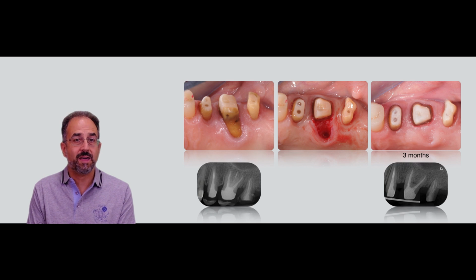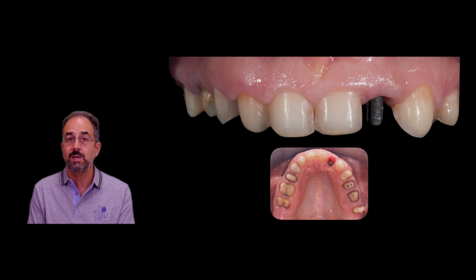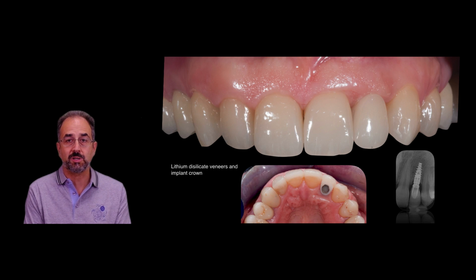And at that point, after proper healing, we carried out the final phase of therapy, and I prepared the upper teeth for veneers. And this is the situation after the cementation of the veneers and delivery of the implant supported crown in the lateral incisor position.